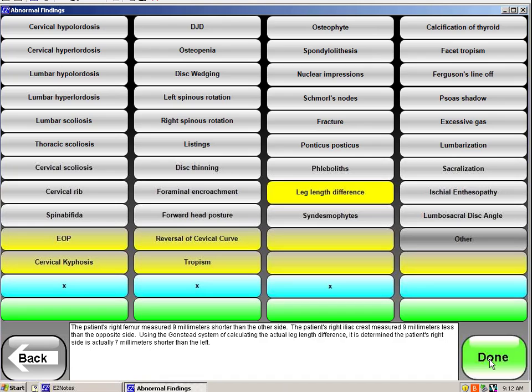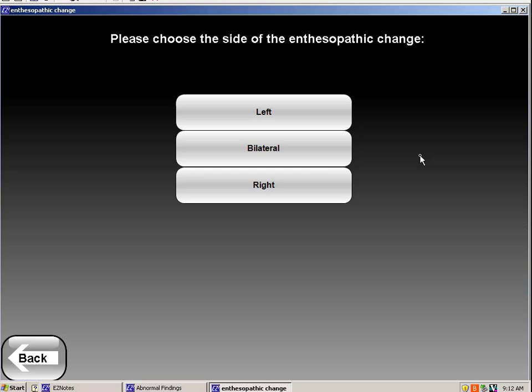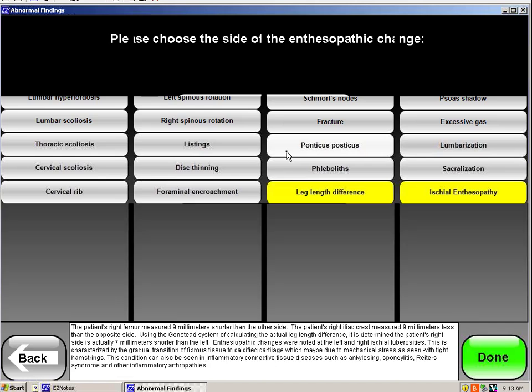Then I look, and I see that the ischial tuberosities are all bumpy, both sides. So if I have bilateral enthesiopathic changes, it would indicate tight hamstrings.